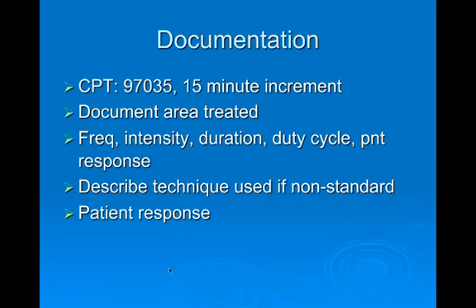Documentation: the CPT code is 97035. Notice that it is a 15-minute increment. That doesn't necessarily mean that the ultrasound's on. You're setting that up and doing your treatment, but it does give you some latitude, so you can extend that from that typical 8 or 10-minute treatment, right? So use that as you need it.